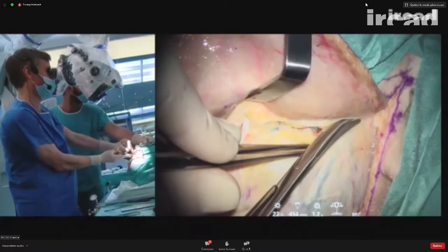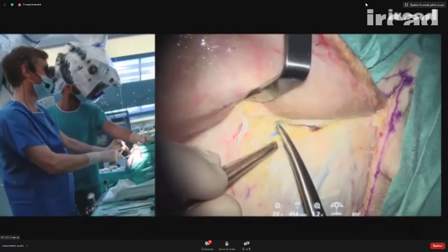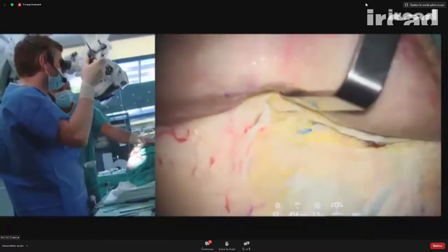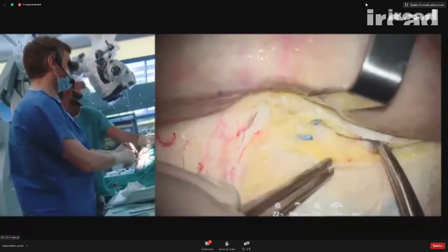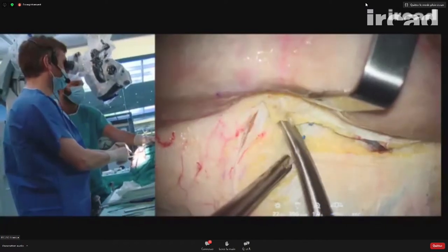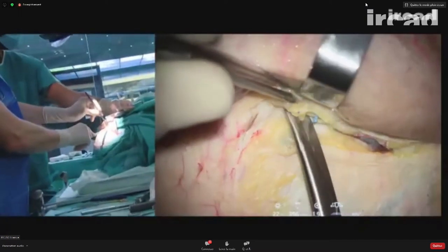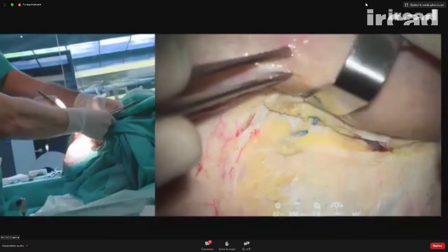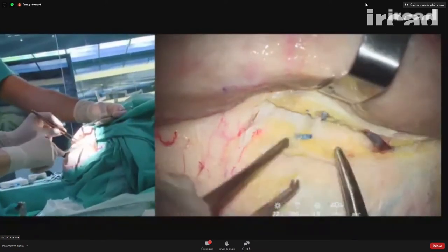I can meet some veins, but those veins can be coagulated quite easily. They are deeper to the superficial fascia. And here now I cut the fat until I find the deep fascia. Here it is.